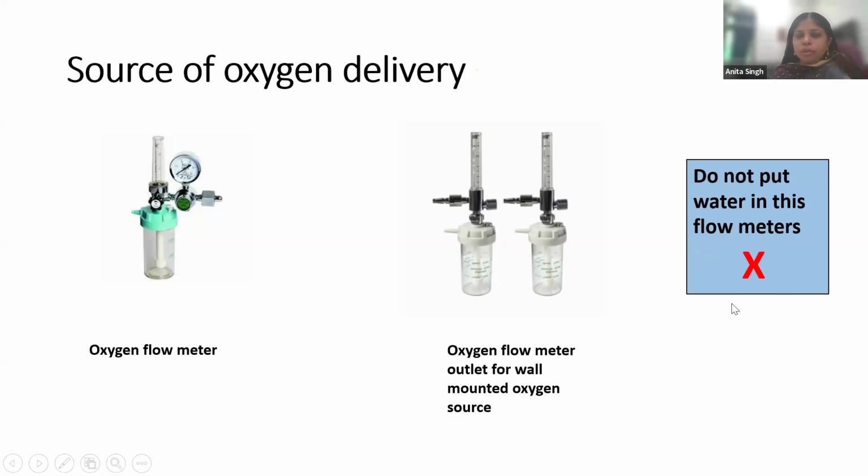So one important point I wanted to emphasize here is that you should not put any water in these flow meters, because this water doesn't serve any purpose, and it is a common source for contamination and growth of bacteria. This used to be a very common practice previously, to put the water in this and change the water every day, but it doesn't serve any purpose, so it should not be done.